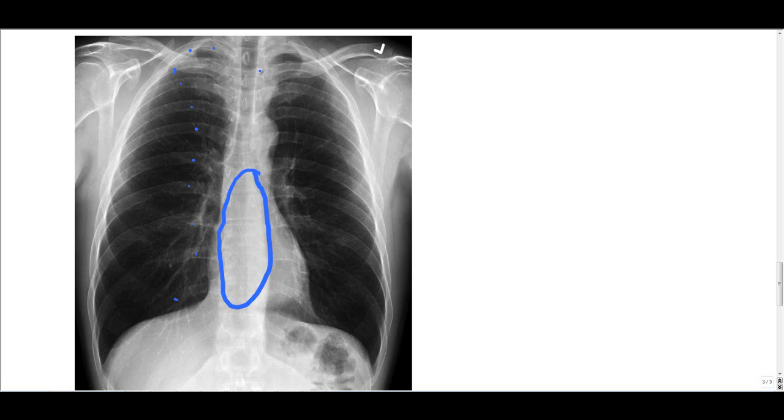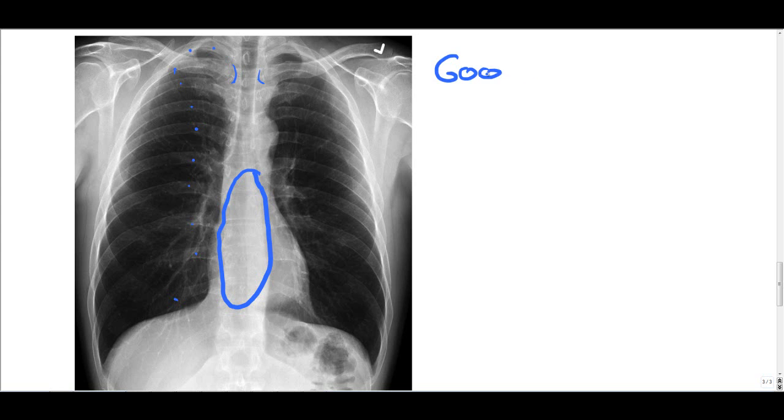Is the patient rotated? Well, you identify the clavicle heads and you identify the thoracic or the spine. And you note that the patient doesn't appear minimally rotated, but very little rotation, if any. So very good. So I would say this is a pretty good x-ray. And this is what you should be looking for in all your x-rays before you actually determine if there are any diseases present.